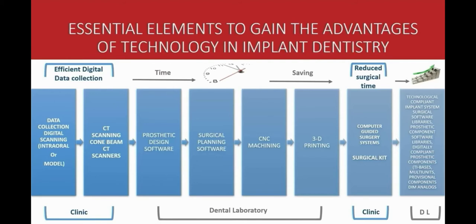Your first appointment may include taking medical history, clinical images, CBCT, and an intraoral scan. Your next appointment will be on the day of surgery, where you will have all the necessary components ready in advance, such as the surgical guide, implants, abutments, temporary restoration, instruments, regenerative materials, and more.